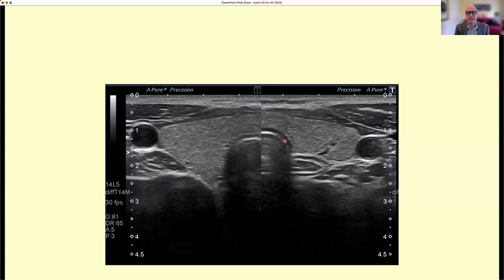Here is the trachea. There is a lot of reflection from the cartilage. The cartilage doesn't let any ultrasound go through, and the air dissipates it promptly. And you see the shadowing because the trachea is round, but nothing gets generated from behind it, because the ultrasound that entered the air will dissipate rapidly and will not be able to reach the area behind the trachea. Any questions about that?